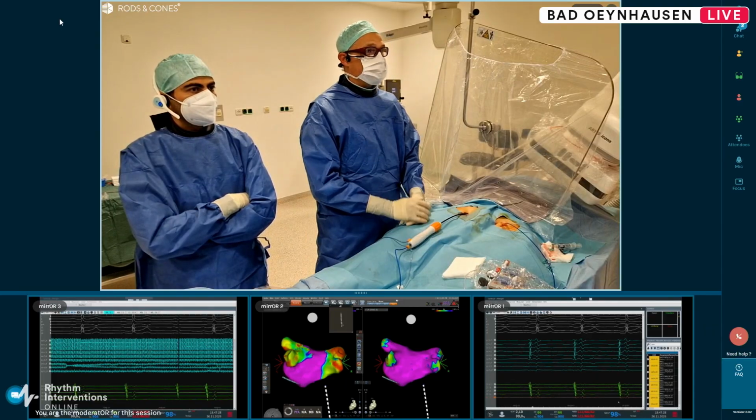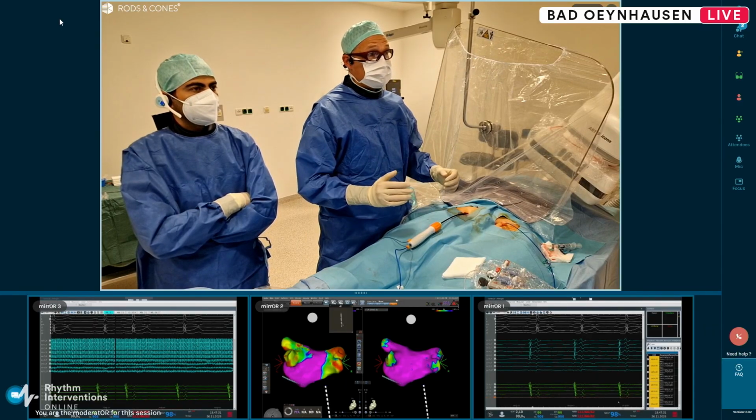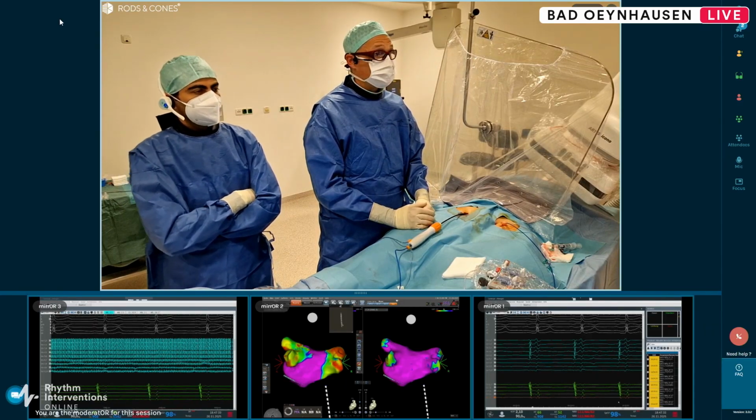and everything you can take out of this problematic road is at least the benefit for the procedure.